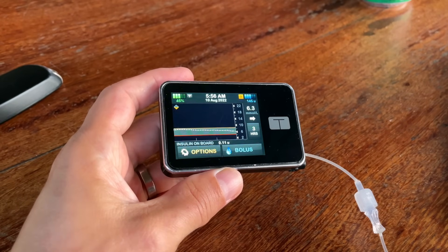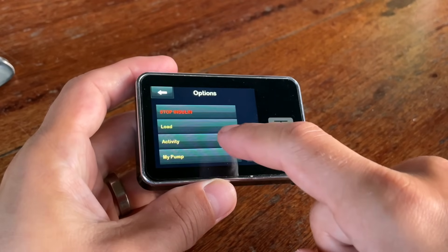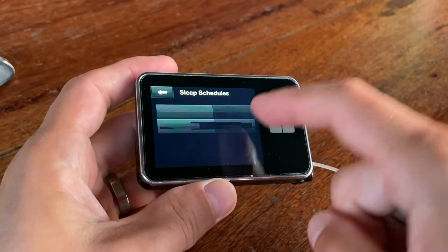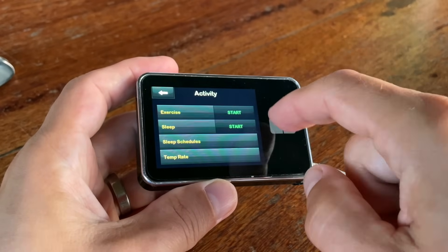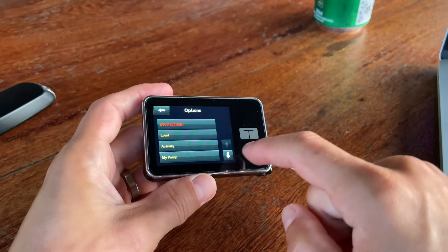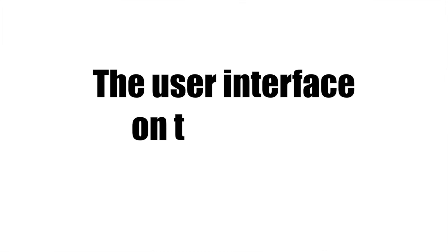The pump has a color touchscreen and everything on the screen looks really modern. The settings are extremely user-friendly and it's super easy to navigate — just like a phone. I really like the home screen button that takes you back to the home screen from anywhere in the menu, which I was missing on all my previous pumps. Overall the user interface on this pump gets five stars.